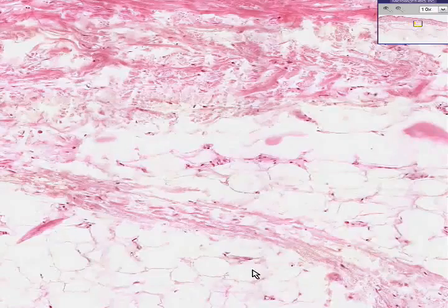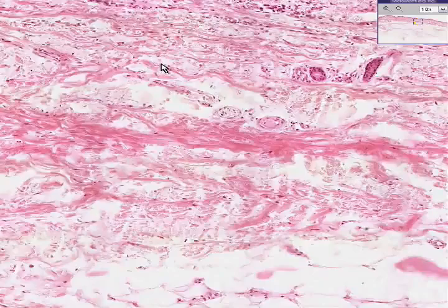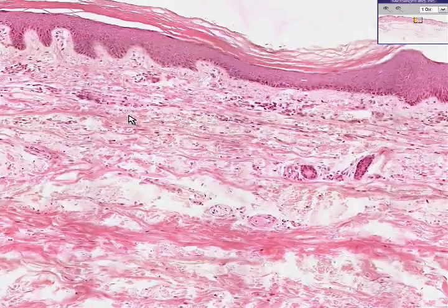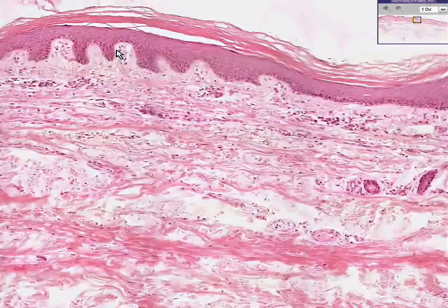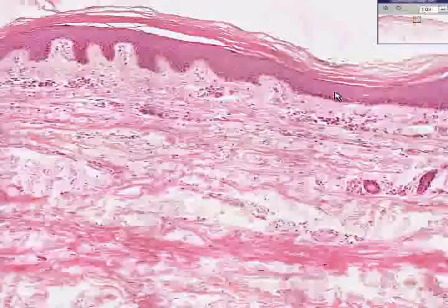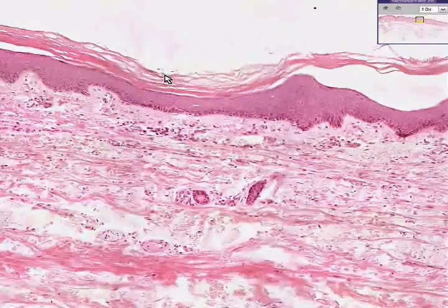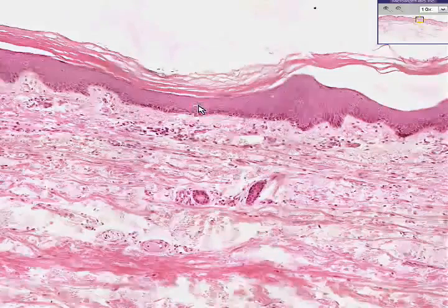So going backwards, we have the hypodermis, loose fatty connective tissue, the reticular dermis, which is the denser, thicker collagen bundles arranged every which way because the skin is subject to forces in every direction. Then we have between the rete pegs, or the projections of the epidermis, the papillary dermis, because they look like papillary projections. Then we have the various layers of the epidermis, and because the stratum corneum is thinner generally than the rest of the epidermis, this is called thin skin.